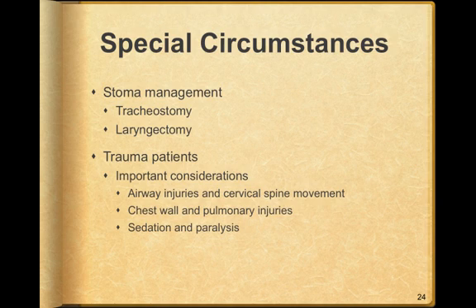The individuals that have had a laryngectomy, or removal of the larynx, sometimes will have, or most of the time will have, just a pocket of skin that is put over the tracheal opening because they've had their entire voice box removed. Now, in doing so, if you try to orally intubate these individuals, you'll never hit your mark. The management must be done through the stoma site or the front of their neck.